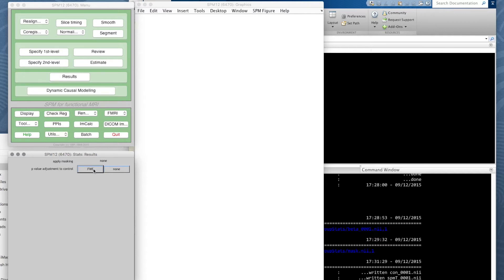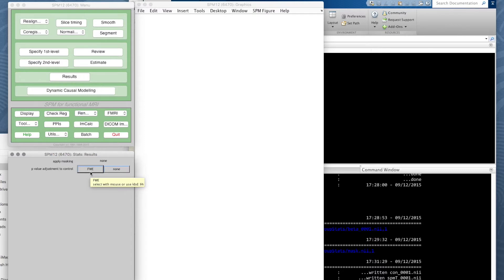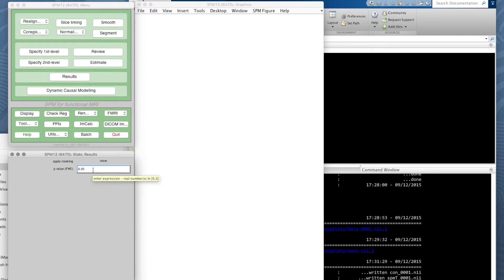Of course, we're doing tens of thousands of simultaneous statistical comparisons, so the p-value has to be adjusted for all these multiple comparisons. The way we tend to do it is with FWE, family-wise error. When we use the FWE correction, we can just use a normal 0.05 or 5%, one in 20 threshold.